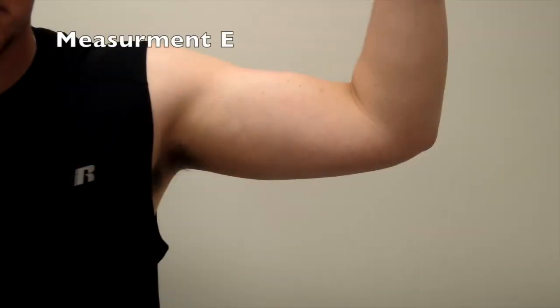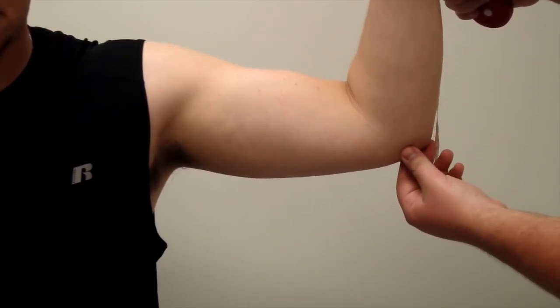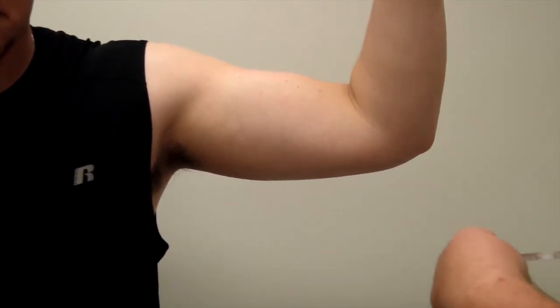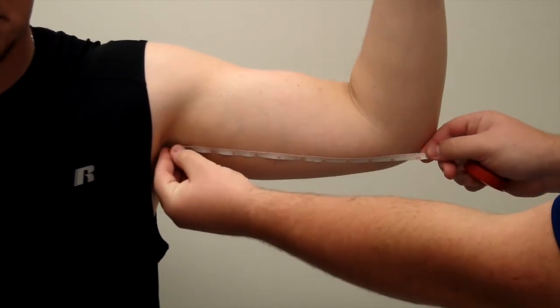Measurement E. Locate the axilla, or armpit, and the medial epicondyle. The medial epicondyle is the bony protuberance on the medial side of the elbow. Next, measure the distance between these two points.